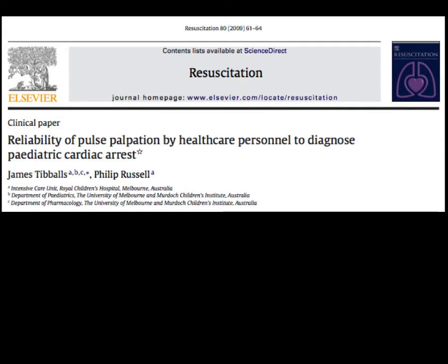In this study, they brought in providers and they were blinded to the hemodynamic data showing in the monitors of these patients. And the patients were at different stages of recovery. So they had different degrees of native cardiac function. And as you know, when patients have a mechanical support device that has continuous flow, as is the case with most newer devices, they don't have a pulse.